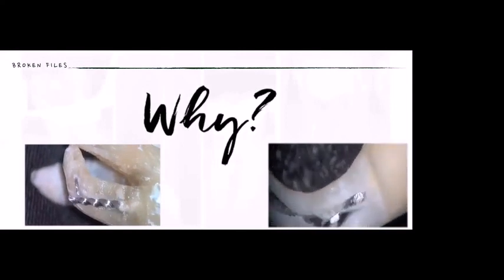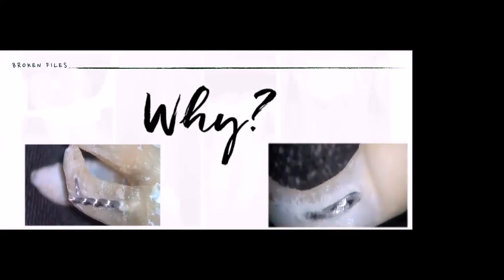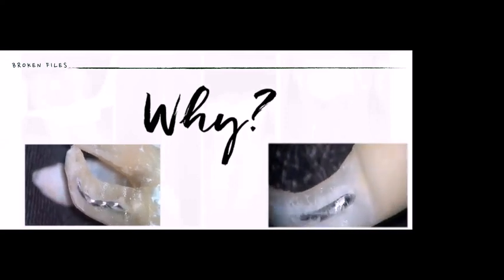Using NiTi rotary files or reciprocating files to shape the root canal has a lot of advantages. It's easier to shape the root canal, we are going to obtain better results, apical transportation is much more difficult, and it's much more difficult to make perforations.